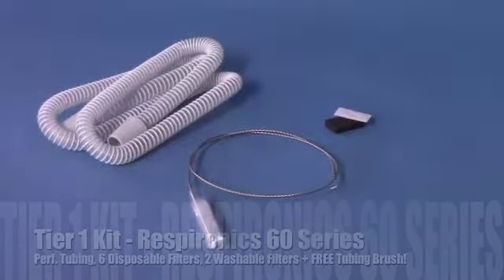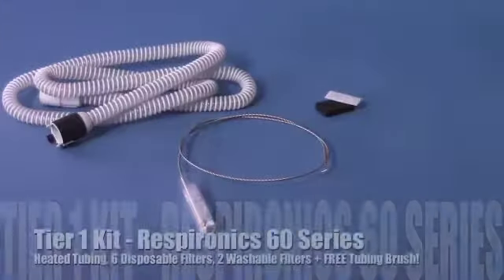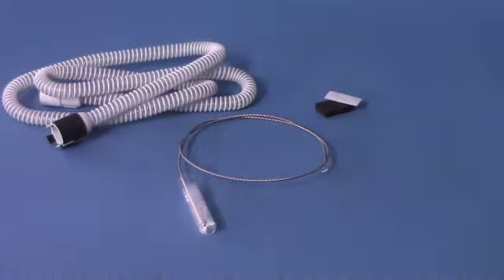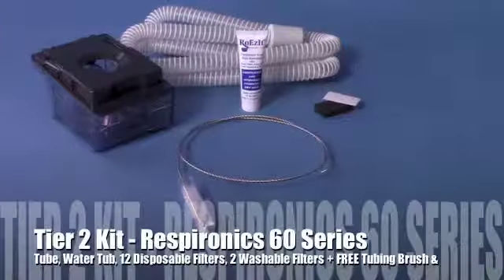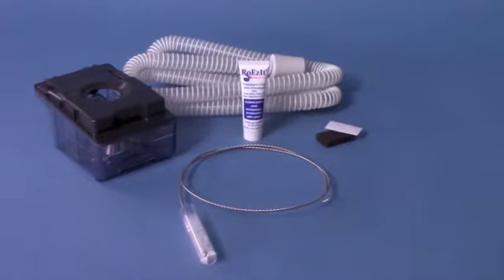Respironic 60 Series CPAP machines feature flex family technology, which provides optimal CPAP therapy at the lowest amount of pressure available. CFlex will monitor each breath and lower the pressure on a breath-by-breath basis, returning to normal pressure upon inhale.